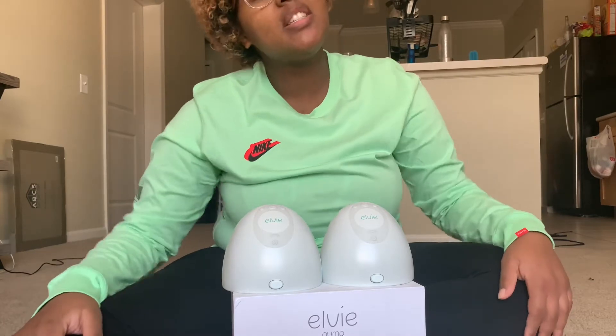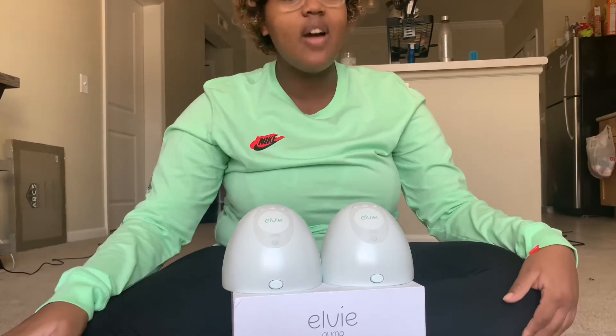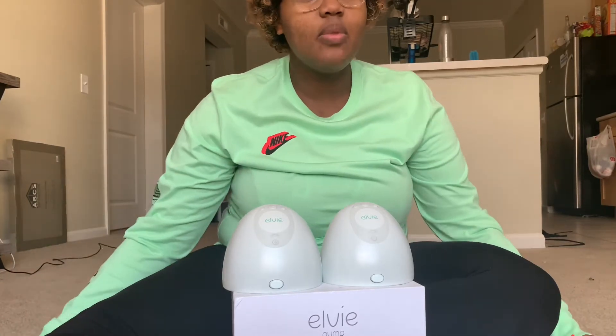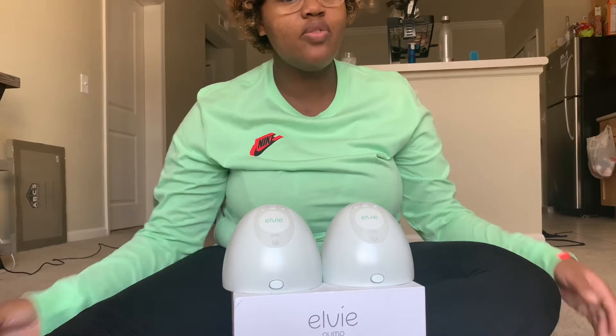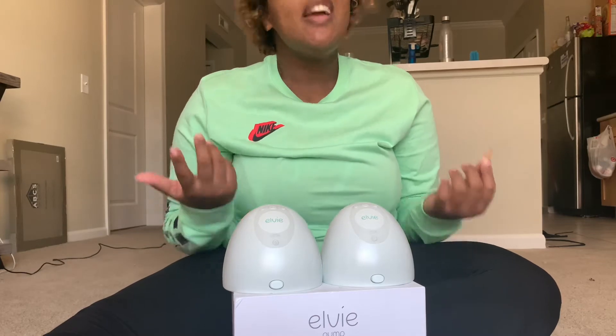So I think the biggest thing everybody wants to know is: is the Elvie worth it? The price tag on the Elvie is $500. Is it worth it? In my opinion, definitely not. There are definitely other ways to make pumping more efficient that do not involve spending $500.